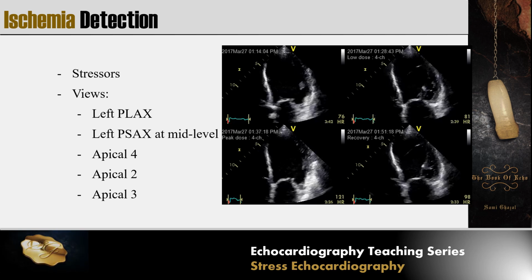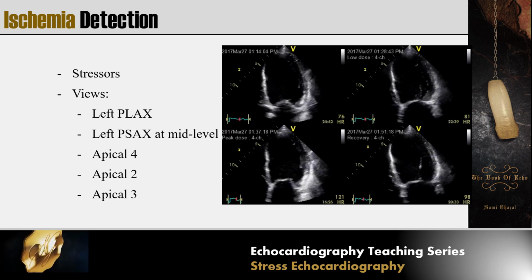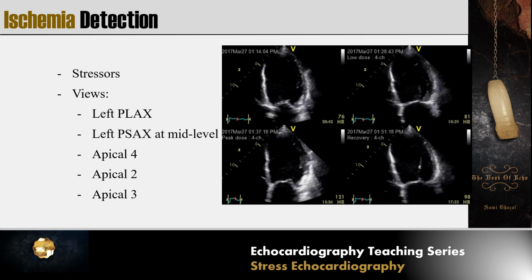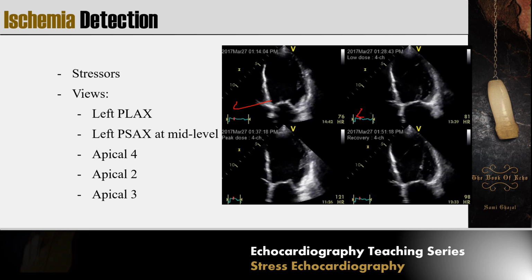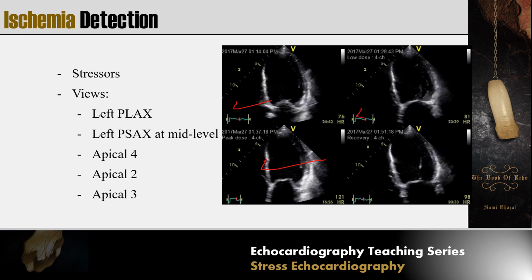This is an example here of stress echocardiography, and you can see the images side by side. Because we used Dobutamine here, you can see the resting image and then the low dose, and also the peak dose and recovery.